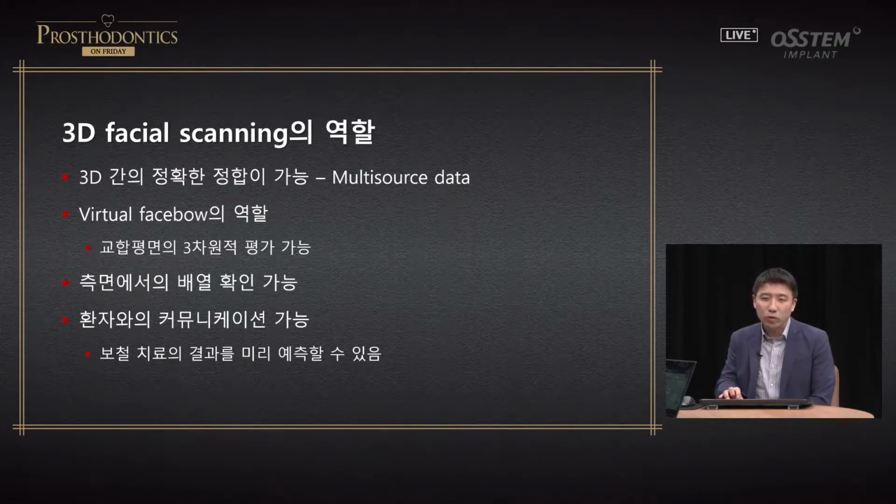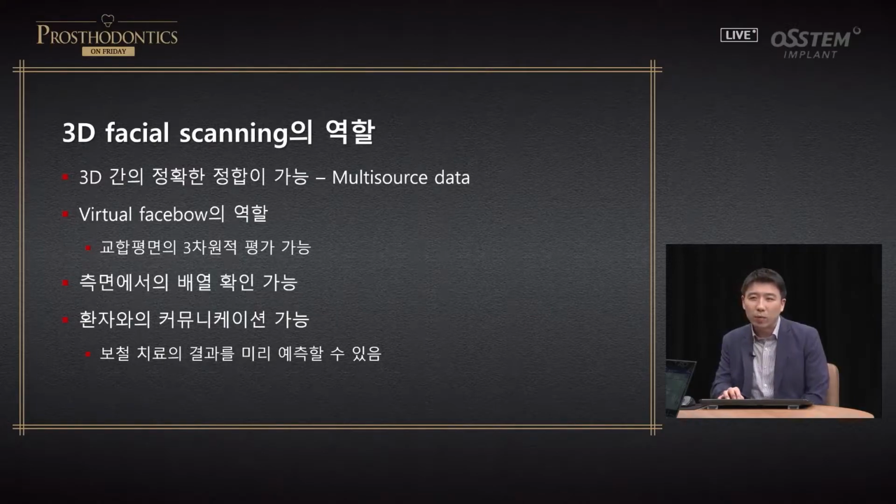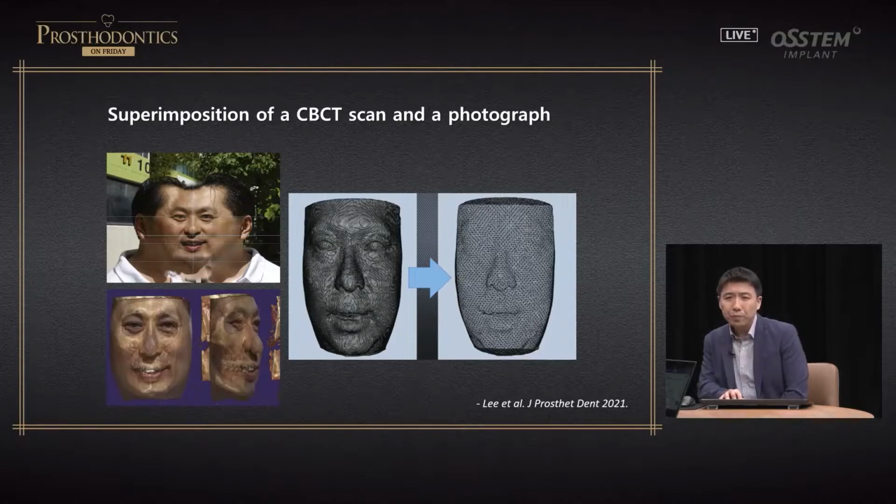As mentioned before, you can analyze occlusal plane, and it's very helpful in that end. Unlike images, you can look at how it is on the lateral view. You can check how the prosthesis is going to look depending on different angles, and you can analyze existing dentition. It really helps in communication with the patient and lab technicians, and I believe this is really useful.